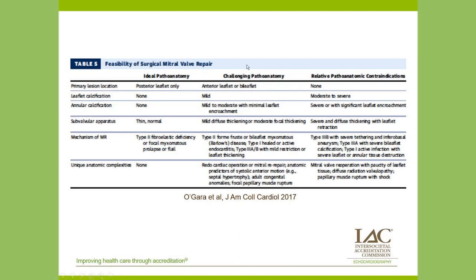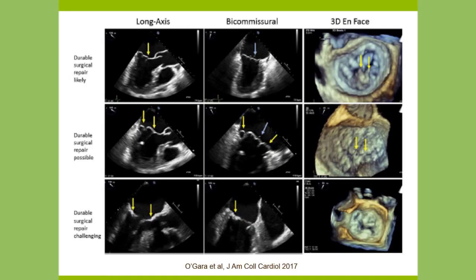And in the middle, these are challenging anatomies, but these are things that most good mitral valve surgeons can repair, but most general cardiac surgeons cannot. Again, it's important to identify this on echo so we know, is this a repairable valve, is this not, and who should we send it to get fixed. These are just some examples of that from the O'Gara paper.